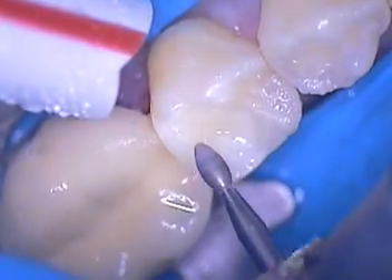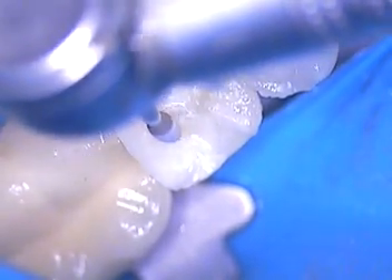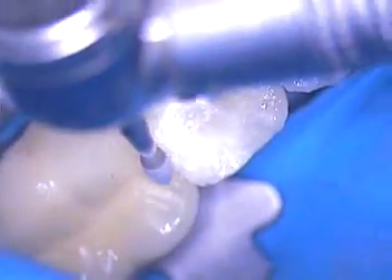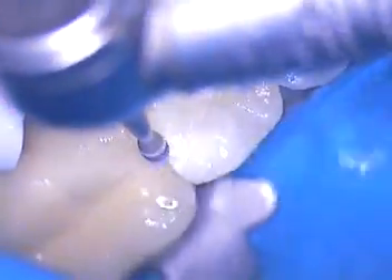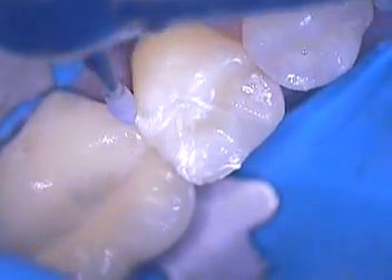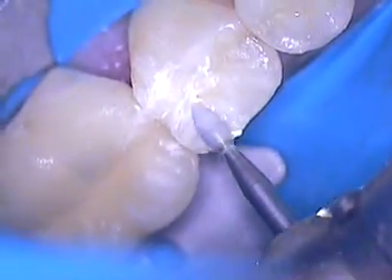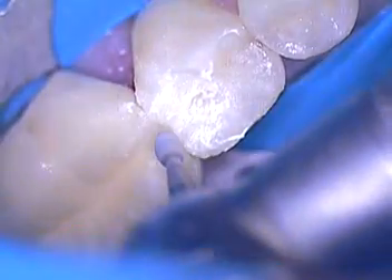We're just about ready to take the rubber dam off. What I'd like to do is just polish the occlusal, and then I'm going to use some points. I like the Centrix points. I'll be asking for the points next. Go ahead and load the first point — that's the yellow one — and we're good to go.